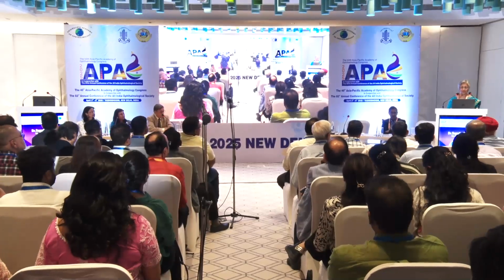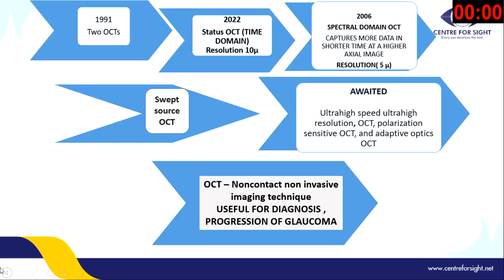And I'll go straight into what is the role of OCT in glaucoma. We all know that glaucoma has come a long way. So from, just think about it, 1991. Before, 1 second, Sagrika, is Dr. Richard Gale here? Yeah, okay, thank you. I think maybe we'll take you up after this lecture.